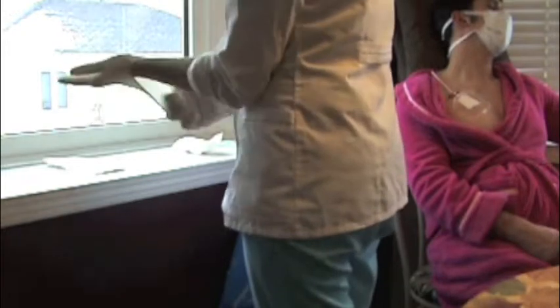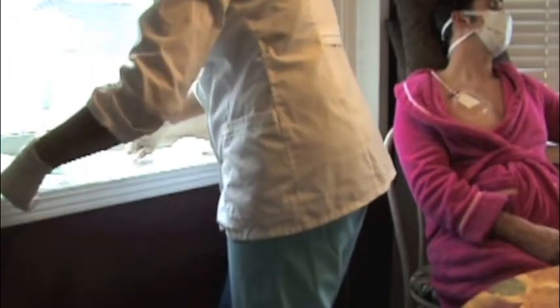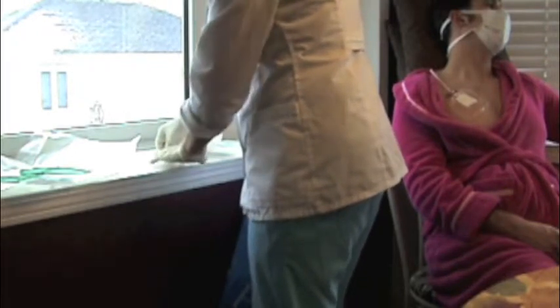I'm going to apply my mask. Don my clean gloves. And before I get started there, I'm going to open up my sterile packages so that they're ready to go. These 2x2s really glued down well.